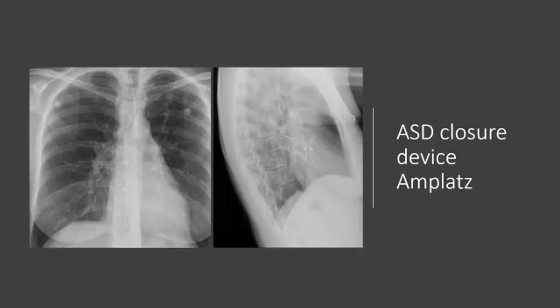Atrial septal defects are among the most common congenital heart defects. Left-to-right shunting can lead to right heart enlargement and dysfunction, with some patients eventually developing pulmonary hypertension. Closure of the atrial septal defect is done surgically, or it can be done percutaneously with this device seen on the images. This is an ASD closure device, also called an AMPLATZ device.